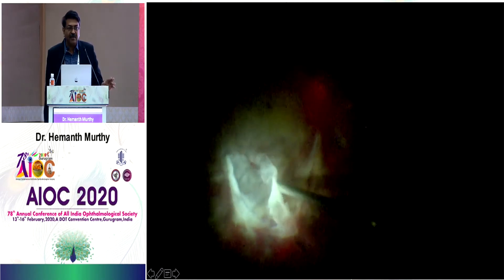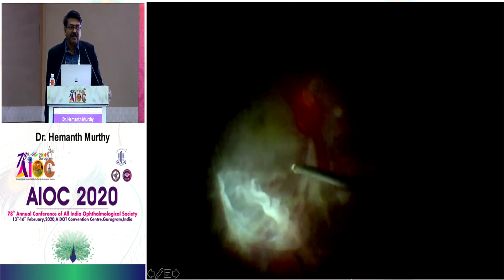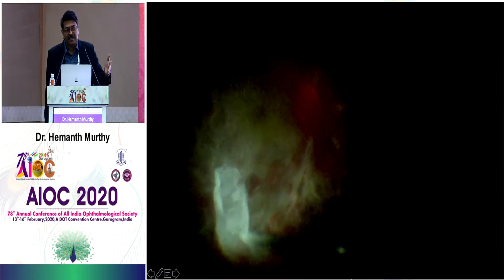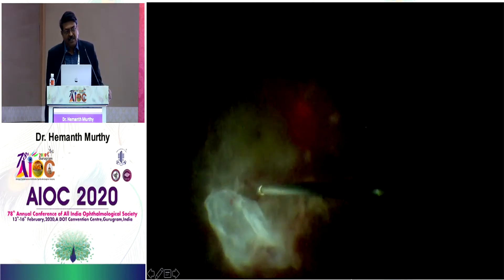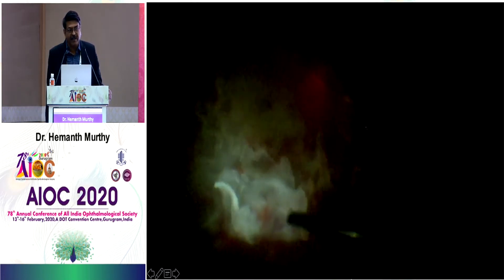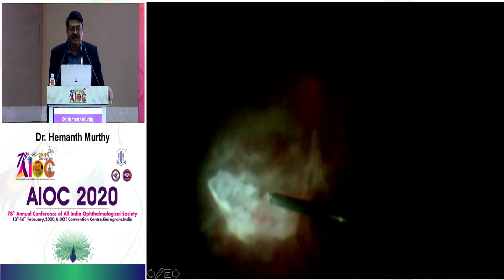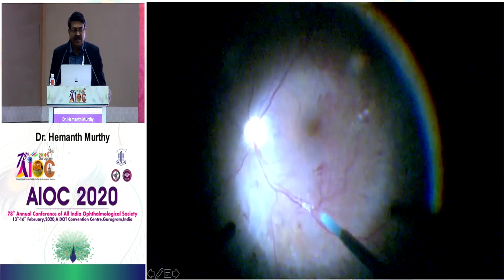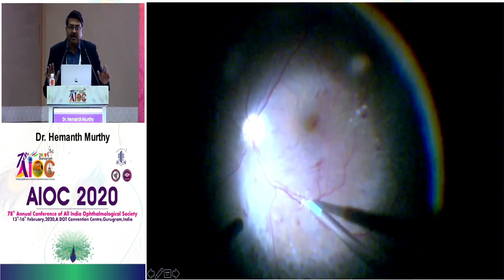Just to show you how, without much effort, it just dissects out. These are tough membranes, but they dissect out very nicely. There is a lot of fluid underneath the retina, but even then the retina behaves very well, so you can clear it off fully.